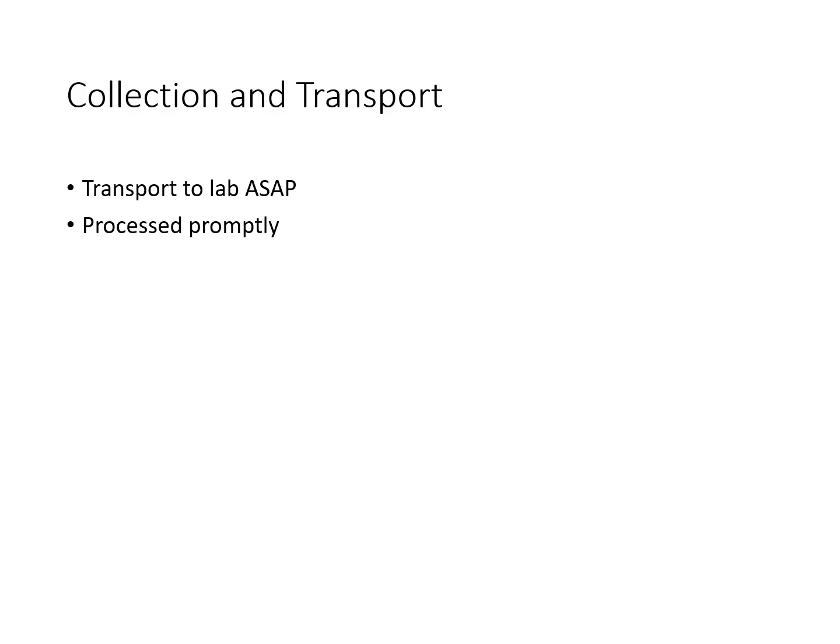Processing upon receipt: samples should be processed promptly. Delays in processing can affect culture results and diagnostic accuracy. If immediate processing is not possible, we're going to store those samples properly, in a cool temperature, but avoid freezing unless specific protocols require it.